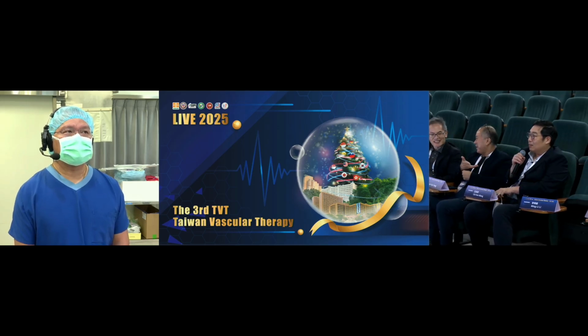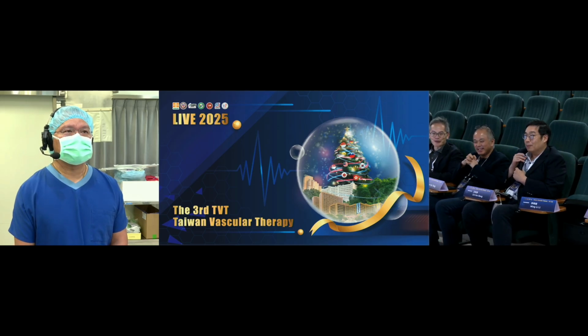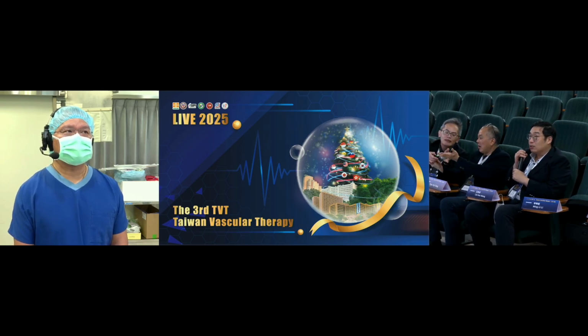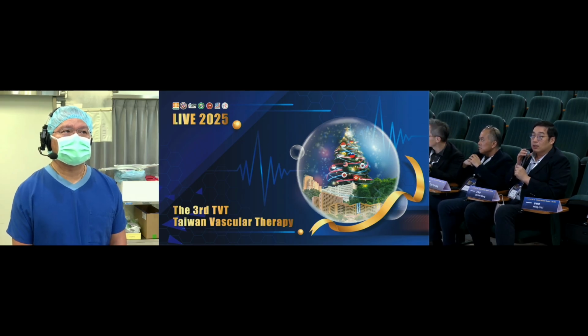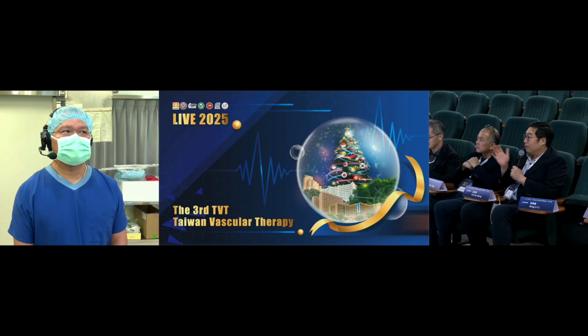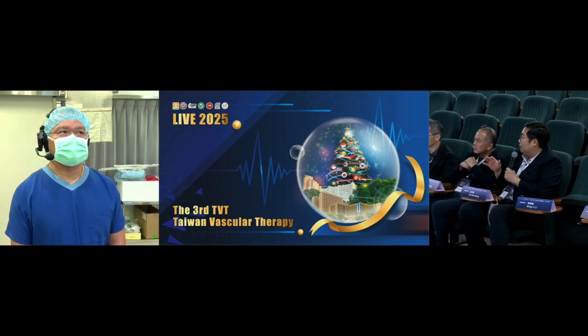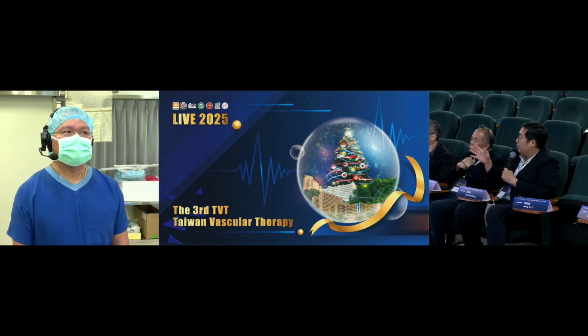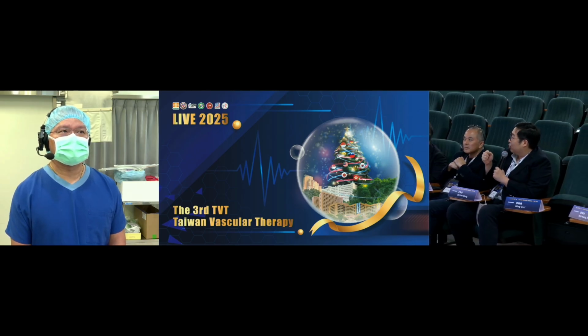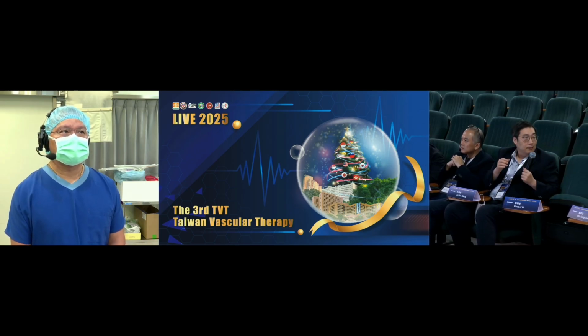Sorry. Yeah, I also agree with all the comments of the panelists. It depends on the patient characteristics because when we do endovascular therapy, sometimes we put the covered stent or Viabahn across the popliteal joint. So sometimes we consider the patient's daily activity. If they have to go to work or do some exercise, I think surgical repair may be more suitable for those patients. Thank you.